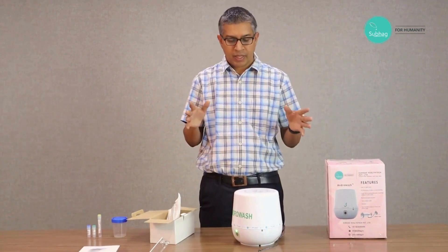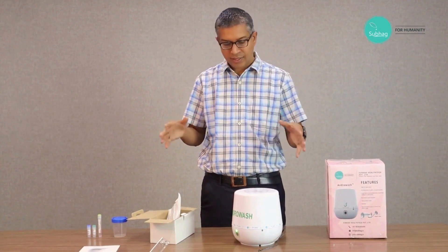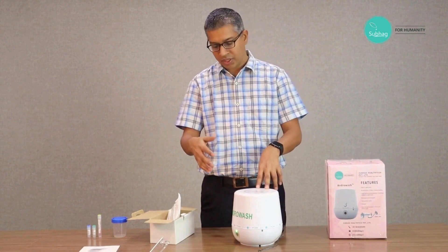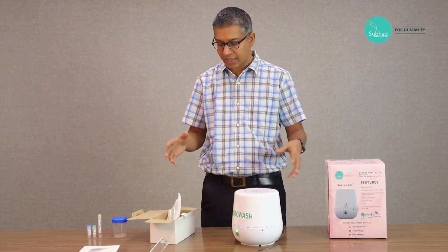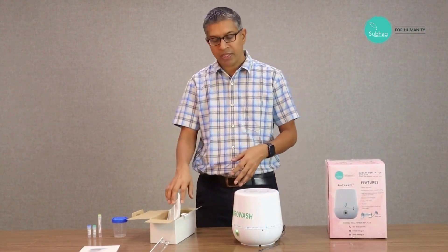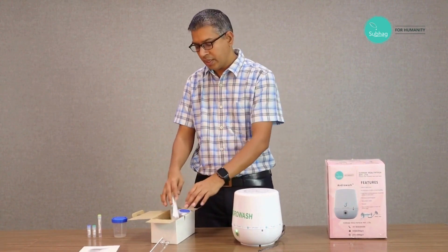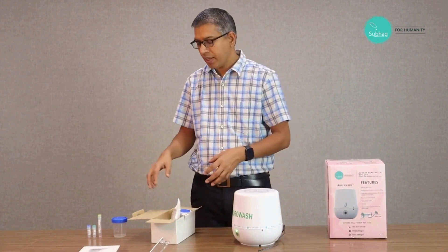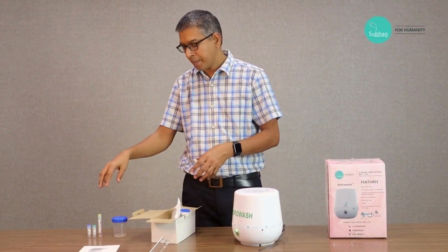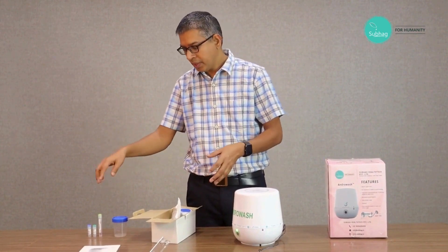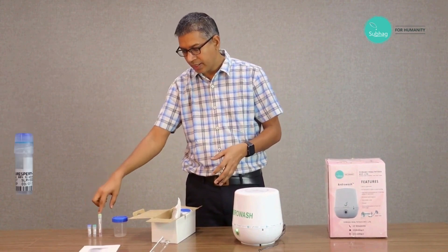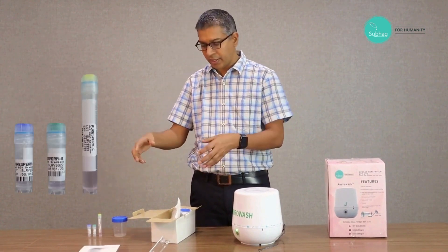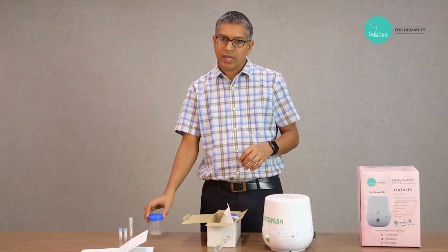For doing this method, what we need is first the centrifuge which is Androwash automatic centrifuge, and then the consumables like the semen collection container, the centrifuge tube, pasture pipette, syringe, etc. Then we need the density gradient medium, the low density medium, high density medium, and culture medium. And then we need the semen sample.